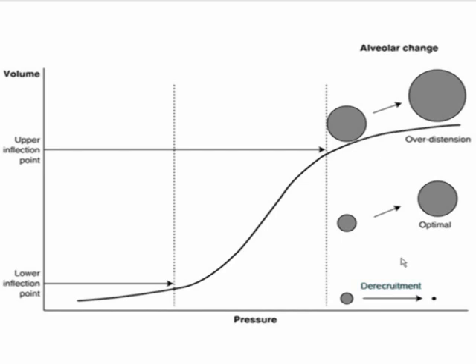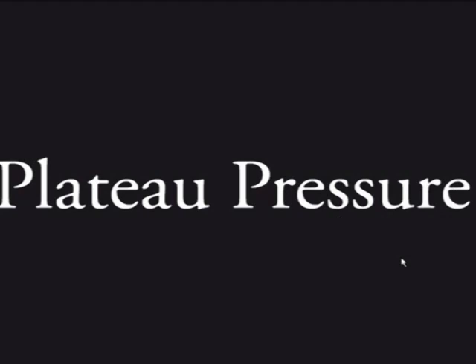And we'll talk about how to make sure that the PEEP and pressures are below that top portion, that over distension portion, in just a second. Right now, the PEEP scale forces you to get to the point where the alveoli are no longer being lost. All right, let's talk about that top portion. How do we avoid the pneumothorax? How do we avoid the patient's head from exploding? The answer is we'll check the plateau pressure.